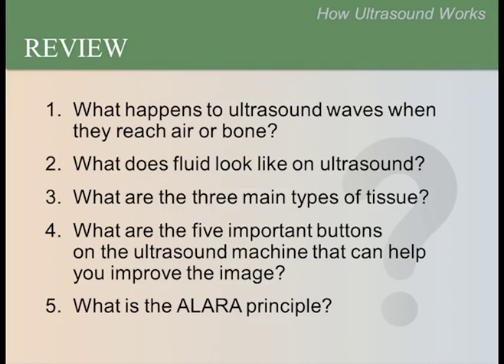What is the ALARA principle? The ALARA principle states that we should scan a fetus only when there is a medical reason, and that we limit the ultrasound exposure during those scans.